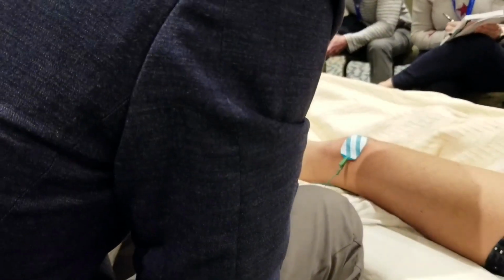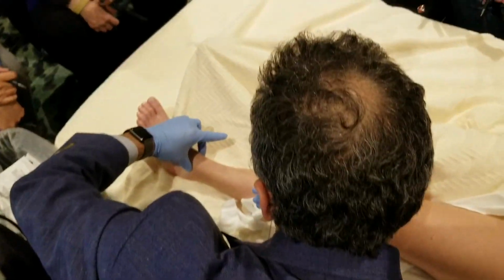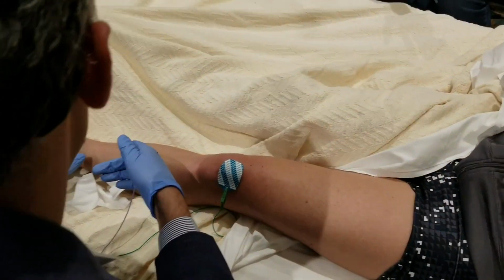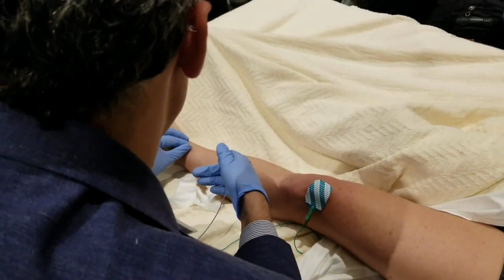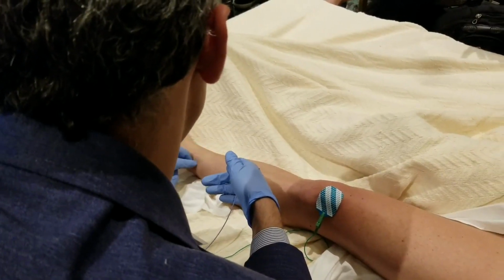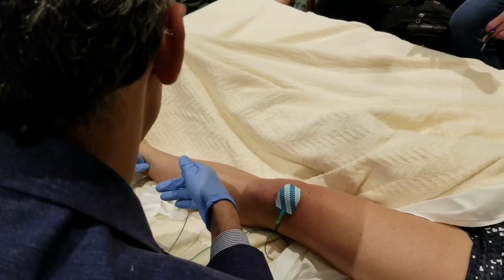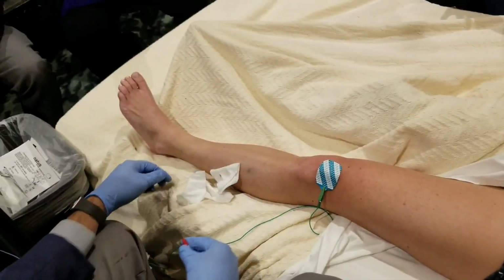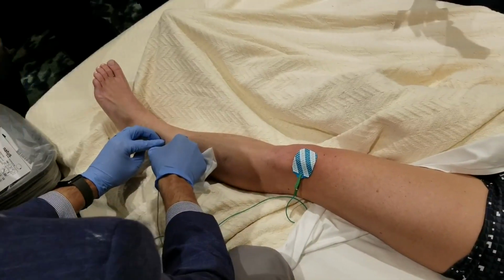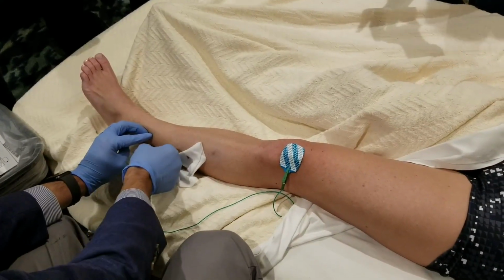So this one, you're going to find what they call the bimalleolar line, which is basically the imaginary line between the two malleoli. And you're going to go about 4 to 5 finger breadths up, and then about 2 centimeters lateral to the tibia here. And then you're going to be in peroneus tertius. So it's a pretty superficial muscle. I approach the muscle from the side like this.